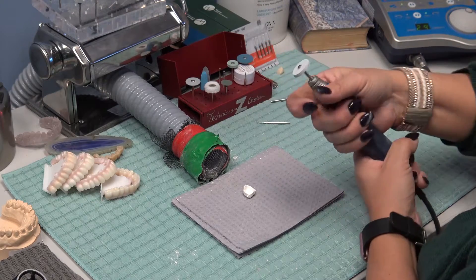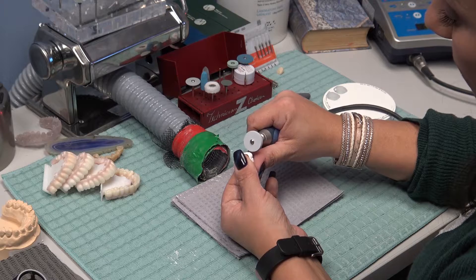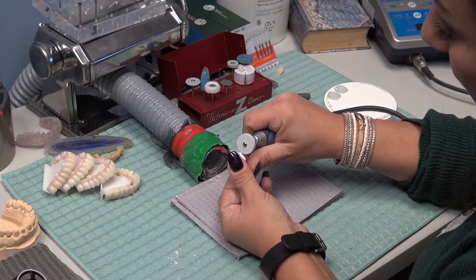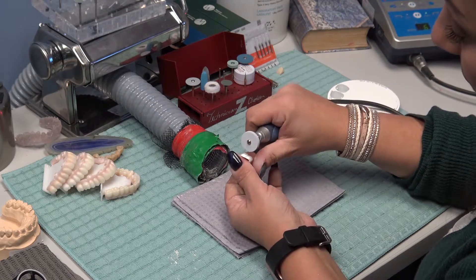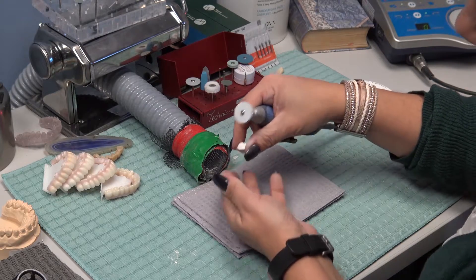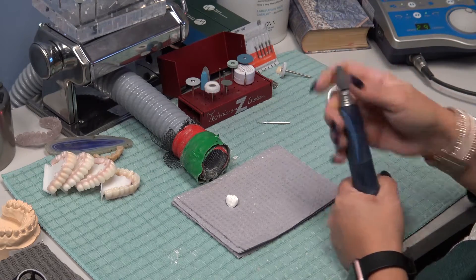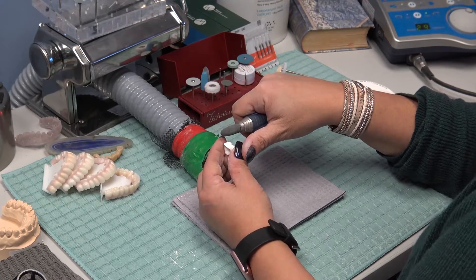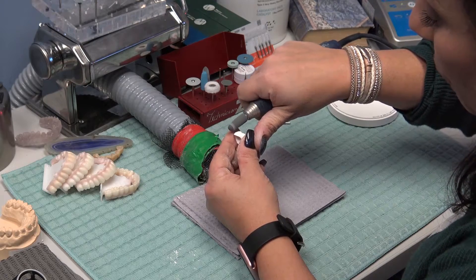The next tool I'm going to use is a white rubber wheel, and I'm going to take down most of what's left of the sprue area so that it's almost flush but not all the way. I personally like to remove the sprue completely — I don't really want to grind on the zirconia after it's sintered. The next tool I'm going to use is a silicone bullet-shaped rubber wheel and I'm going to take down the remainder of the sprue.